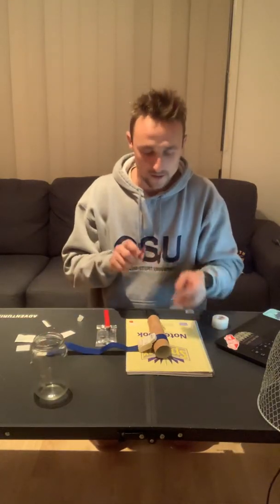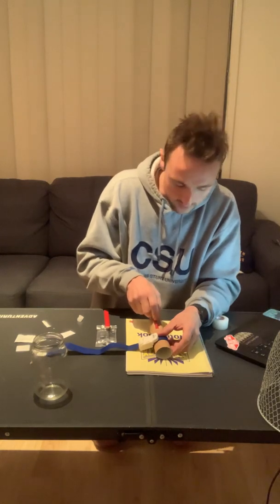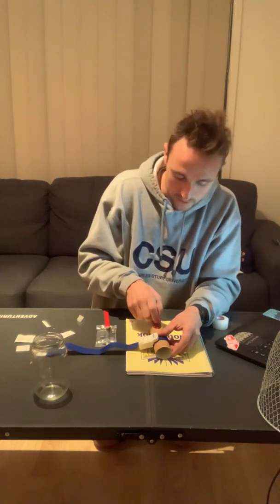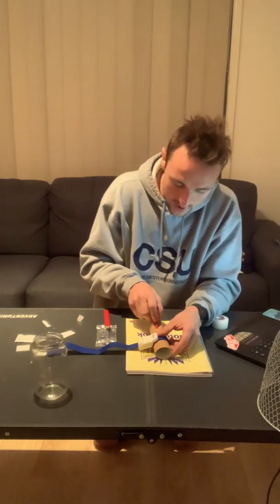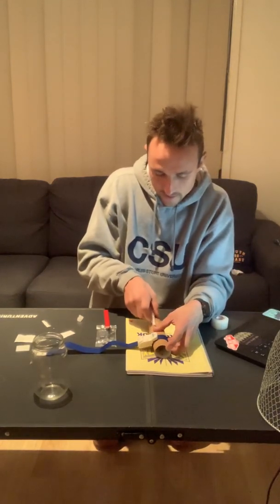I'm going to insert my cannula, but before I do so, I'm going to warn the patient we're going to have a sharp scratch. I'm going to insert the cannula at 15 to 25 degrees. So I'm going to progress the cannula forward until I see flash in the flashback chamber. And once I do so, I'm going to lower the angle of the cannula and insert 2 to 3 millimeters more. Once that's done, I'm then going to slide the cannula back until I hear the safety click.